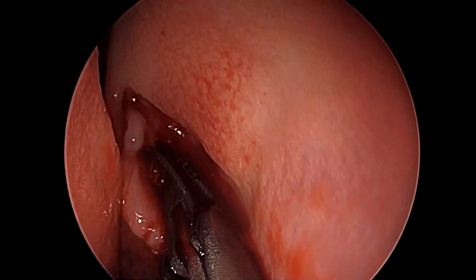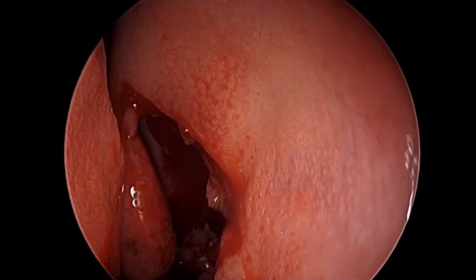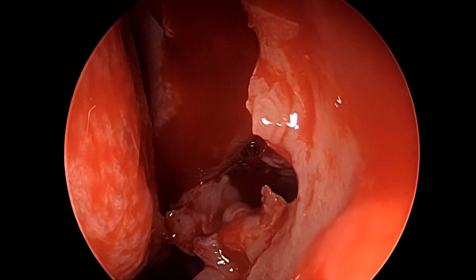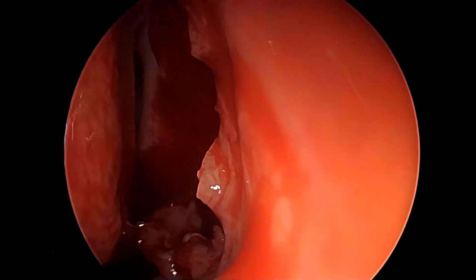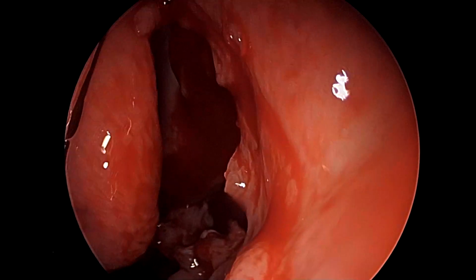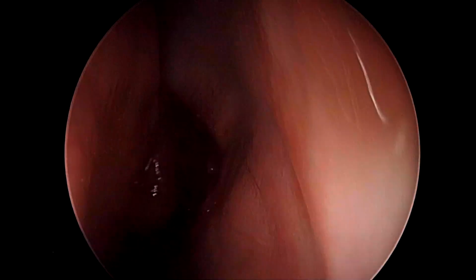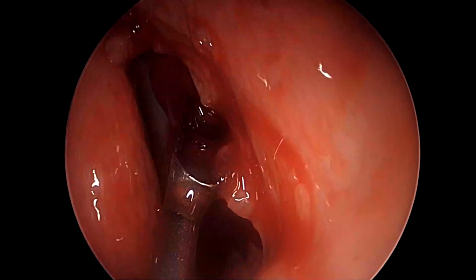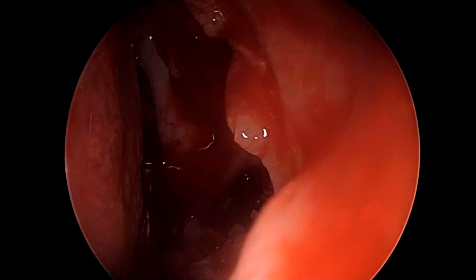An important part here is to make sure that we do not resect the axilla of the middle turbinate itself, because that makes the middle turbinate floppy and much more prone to lateralization, causing eventual sinusitis in the future. As you see here, the removal of the uncinate process flush with the lateral nasal wall right till the superior-most attachment gives us a very good vision of the entire middle meatus area and the ethmoid.